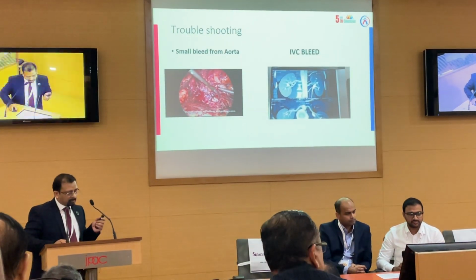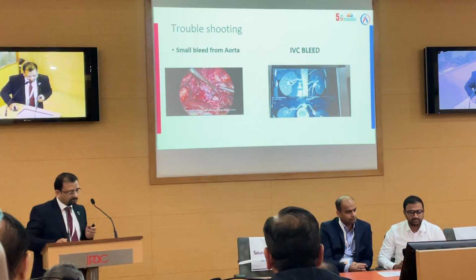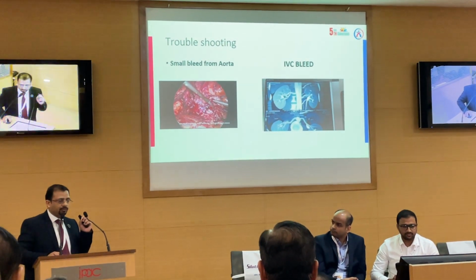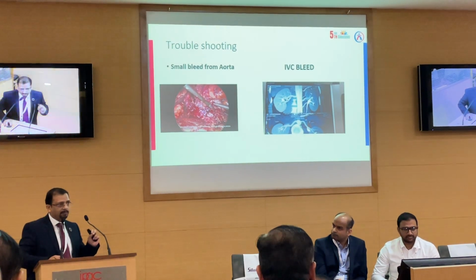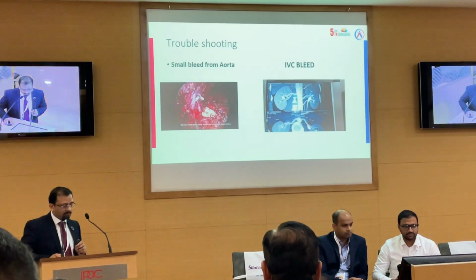So these are troubleshooting; I will skip them because of the time. But the main important thing is whenever you have bleeding, just pack it and wait for some time, and then you can get extra help or an extra port, and that will help you.